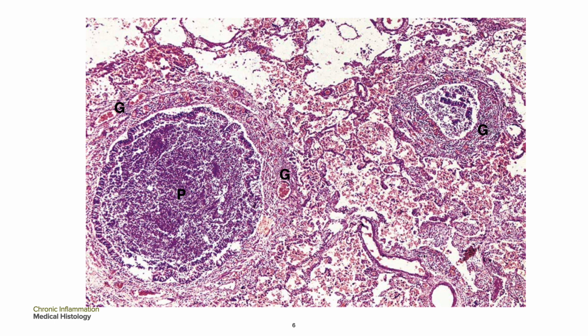This micrograph is showing you a disease called bronchiectasis. This is a chronic inflammation of the bronchi which is associated with destruction of the wall and permanent dilatation. In most cases, repeated episodes of infection and obstruction lead to a progressive destruction of the normal elastic and muscular components of the airway wall. Obstruction may be due to foreign bodies in your bronchi, tumor, structural abnormalities, or stasis of secretions, perhaps related to ciliary malfunction or CF, cystic fibrosis.